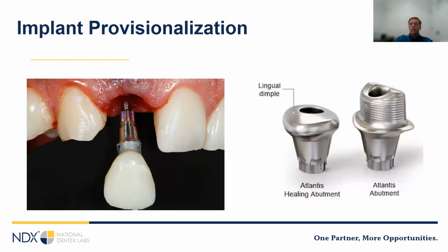We can make a hand-formed custom healing abutment in a flipper or a Nesbit. It works fine. It's difficult to do, and it's difficult to impress. And we'll talk about that in just a minute. And then there's also the Atlantis custom healing abutment.